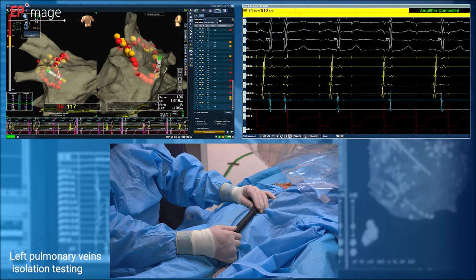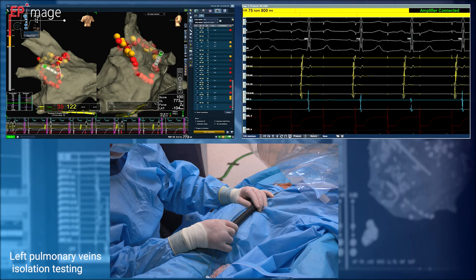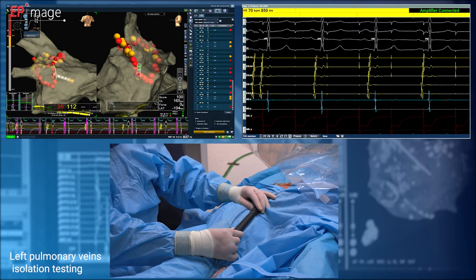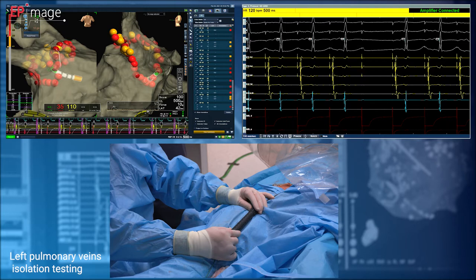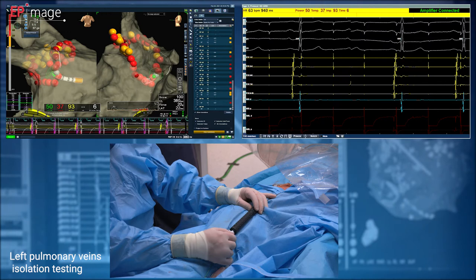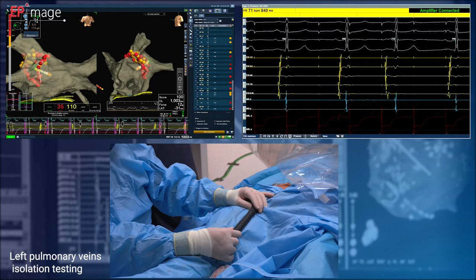Otherwise, you could show that something is isolated, when it's not. So contact force is really helpful for proving that we are pacing the tissue. As you see, we already found a gap on the posterior portion, close to the junction on the posterior, inferior portion of the left inferior pulmonary vein, and during pacing we closed it.